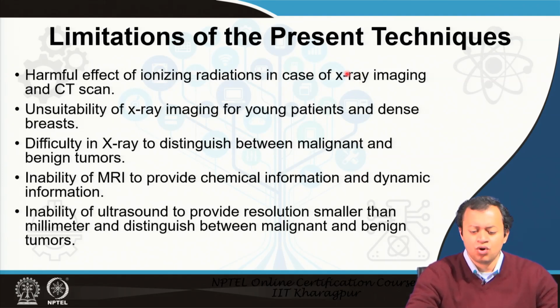But nevertheless, X-ray uses a huge amount of ionizing radiation and it does have harmful effects. Similarly, X-ray imaging is unsuitable for very young patients, for example a newborn child, or if you have a dense breast. We have difficulty in X-ray.